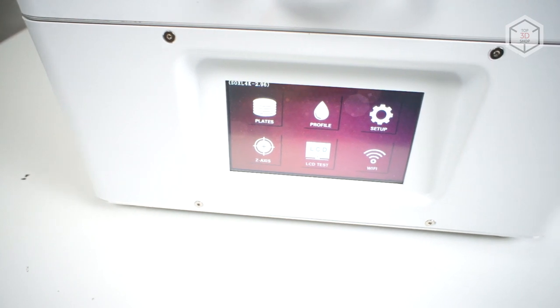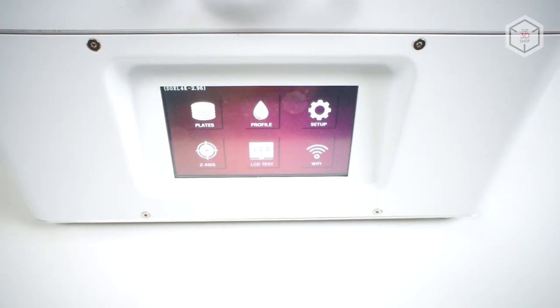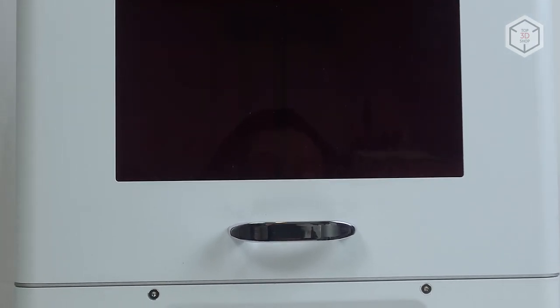The lower part of the front panel houses a large touchscreen. We'll talk about it a bit later. The window is made of tinted plastic that does not release ultraviolet light. The idea here is that the user can watch the printing process through this window, but the plastic is rather dark and almost nothing is visible through it.